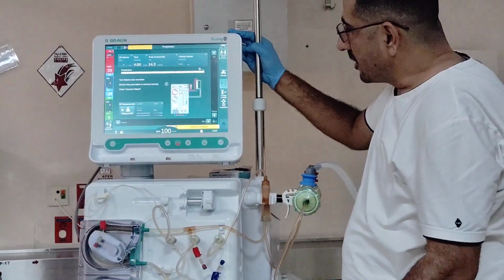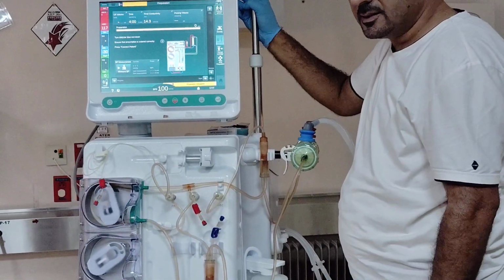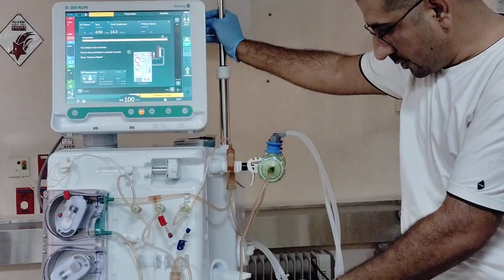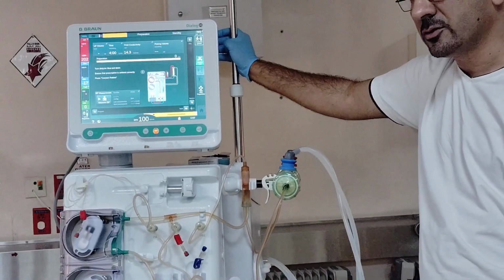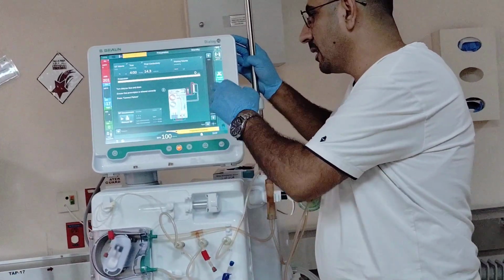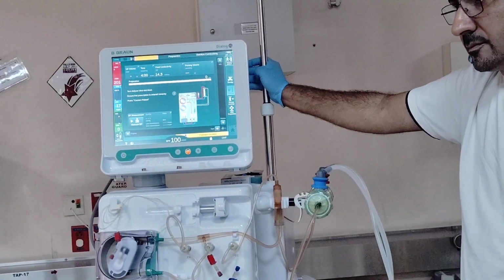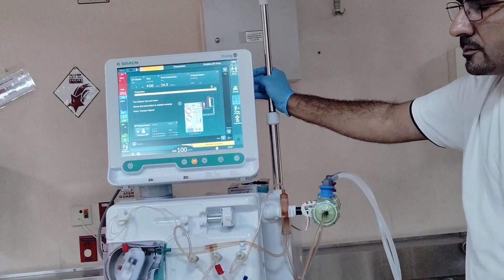In case your machine is ready and the patient is still not ready, you can press on standby. Standby bypass, yes, to save your dialysate consumption and make it zero. Suppose the patient is delayed, and now he is ready, you release the standby. For how many hours can it stay on standby? Up to 2 hours.